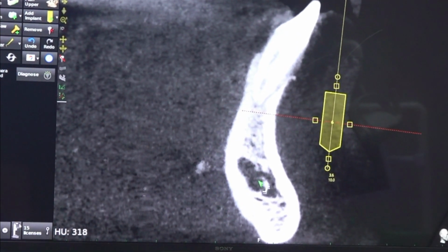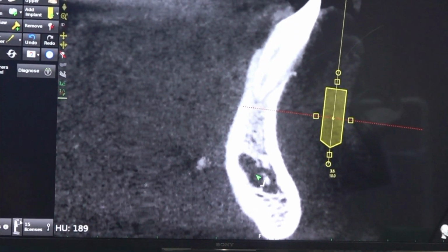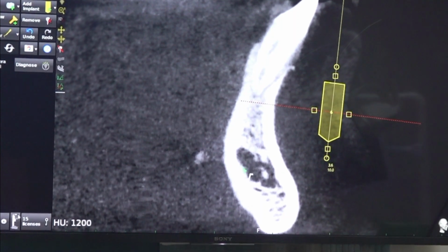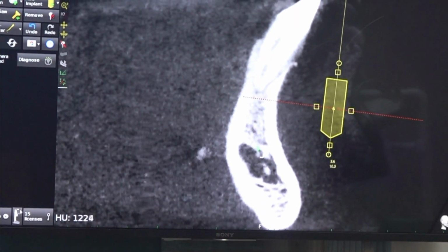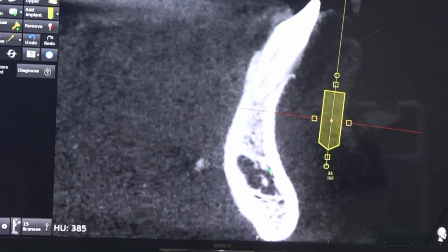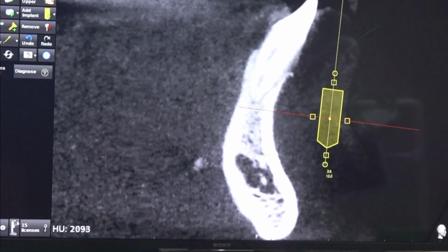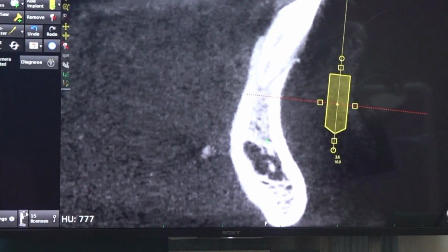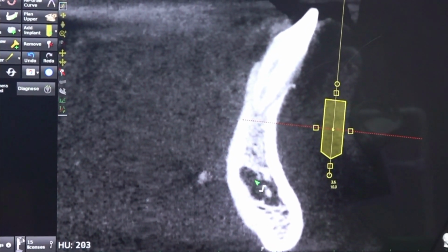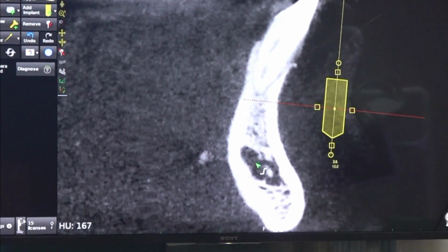There are two advantages, because if you go till here, you may get a stability problem. And not only that, if the mandibular incisive canal is impinged, it may give pain. Another thing is, if there is an artery and vein structure running through, and you induce bleeding, it may lead to bone loss, periapical implantitis, and apical bone loss of the implant. You will see bone loss surrounding the apex of the implant, because if you induce bleeding here, there is no way the bleeding is going to go away. The pressure increases there.